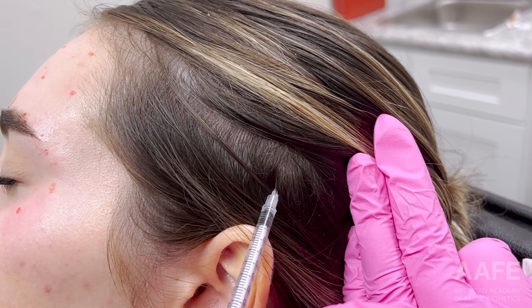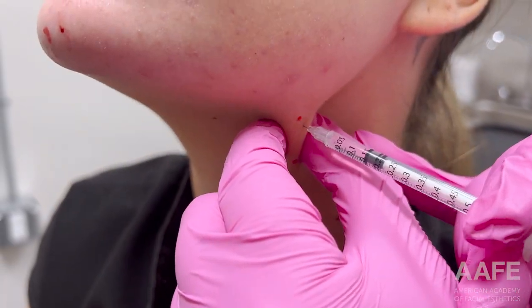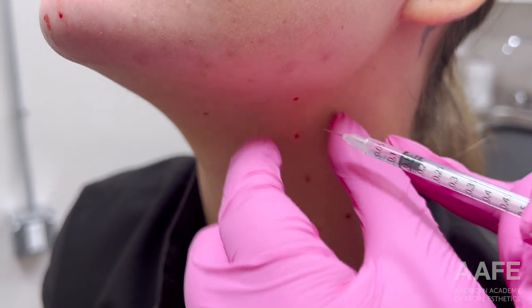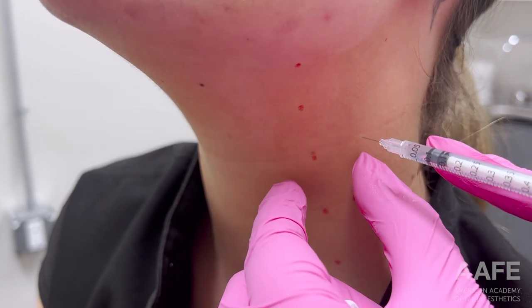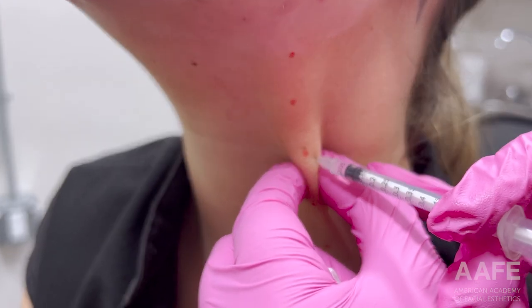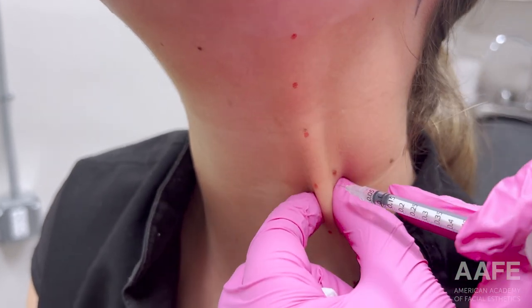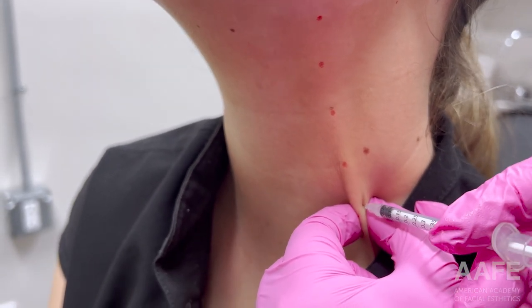This temporalis treatment is definitely more therapeutic, while the rest are more cosmetic. Moving down to her platysma — Elizabeth is very young so her platysma bands aren't too strong, but she definitely loves the look of when they're relaxed. She has two prominent bands that we treat.